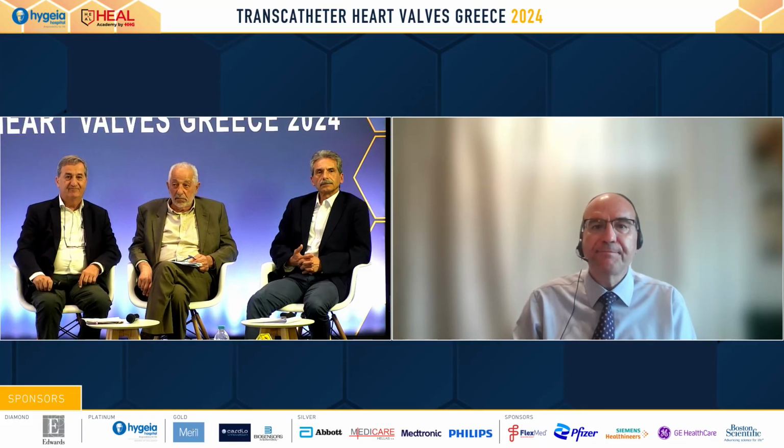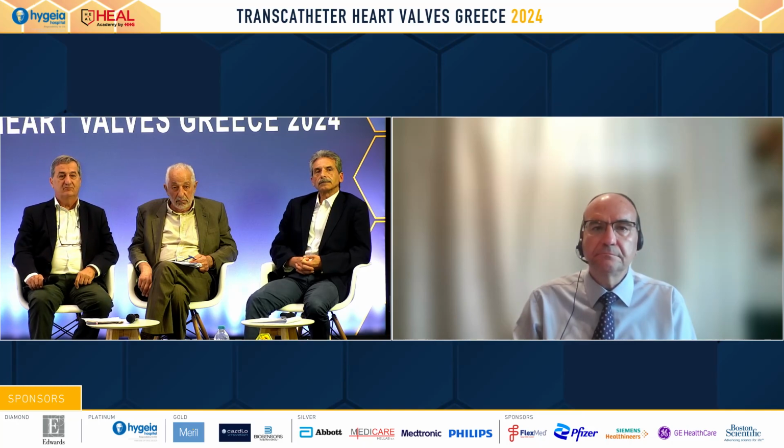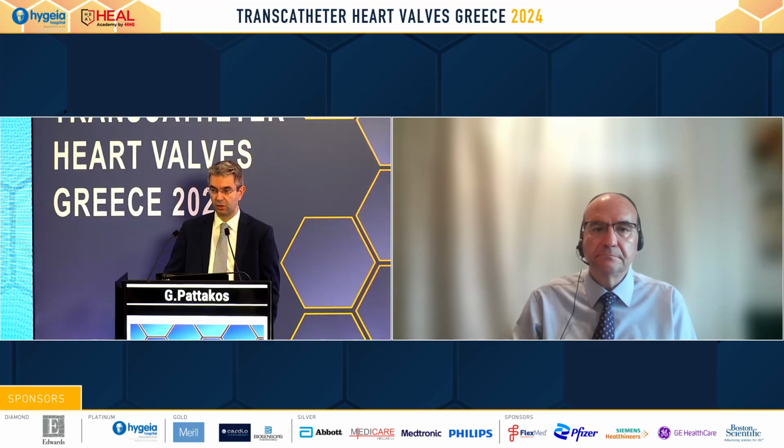Dr. Chrysocheris? Yeah, I wanted to ask, should CT angiography of the aortic root be mandatory also for patients referred for surgical aortic valve replacement? Yeah, I don't know whether it should be mandatory, but I do it very frequently. When there's any discussion, as you know, Mike, I do both. I'm comfortable with both operations. So patients frequently come to see me, not predetermined.